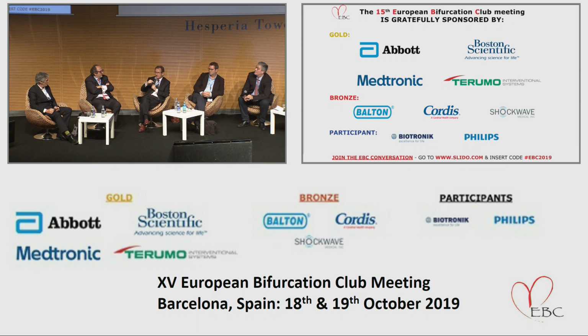But don't forget, if you stent from left main to LAD, and the plaque distribution in the left main is following. In 90%, plaques from left main are going direct to the LAD.